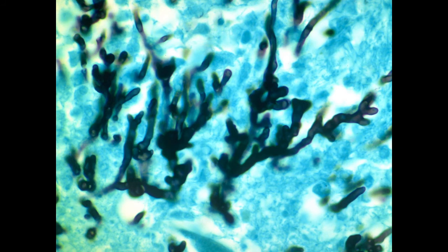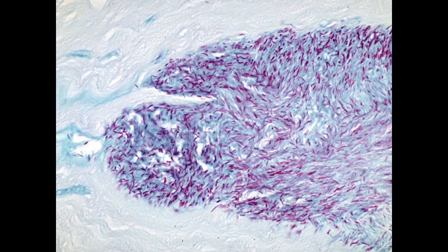This is the GMS stain for fungus. The silver impregnation stain stains the hyphae black, and there is a green counterstain. This acid-fast stain shows a large colony of atypical mycobacteria in the corneal stroma.